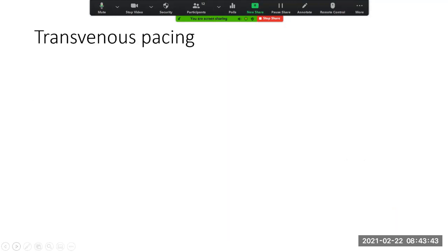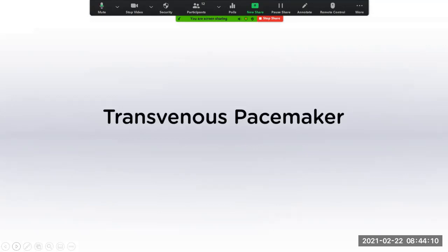All right. Let's see. I think we've got one more. So let's say external pacing doesn't work. At the end of the day, this patient is going to need a pacemaker implanted. But there's still one more trick that we've got up our sleeve, and I want you guys to see it as well. This is something you may see if you're lucky to work in an emergency department, relatively often. We haven't done one in the last 5 years though. So it's normally in one of the bigger centers, but at least if somebody mentions it, you should know what it is, and that's transvenous pacing.